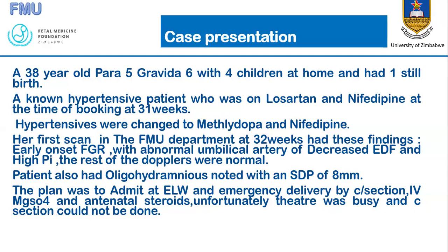Like what Dr. Verenga always says, you're not supposed to scan a patient that you don't know. You have to know the patient that you're scanning, meaning you have to know the background, the medical history, the social history of that patient. And also how best we can diagnose or differentiate some conditions in FGR, in fetal growth restricted babies.